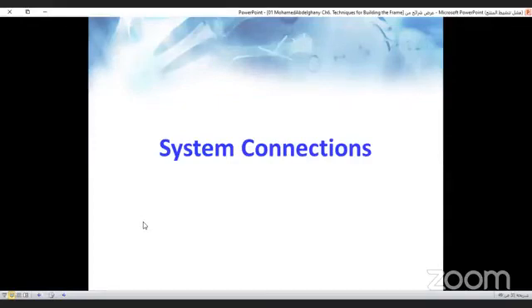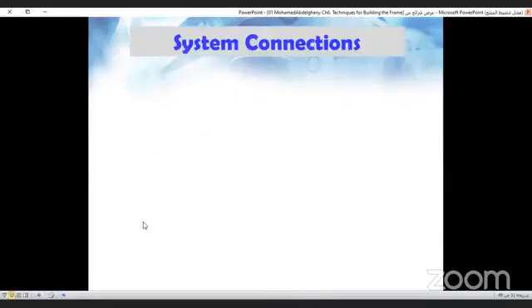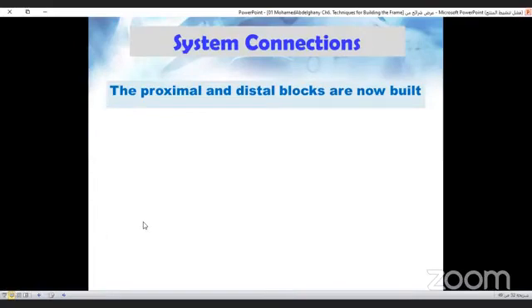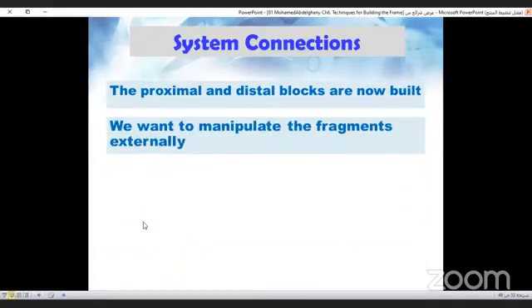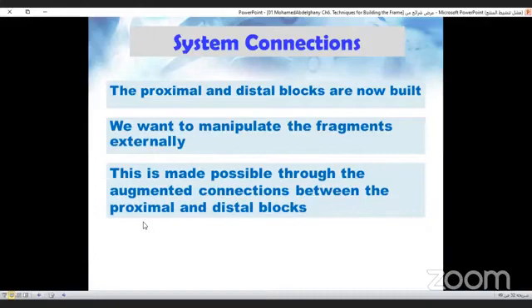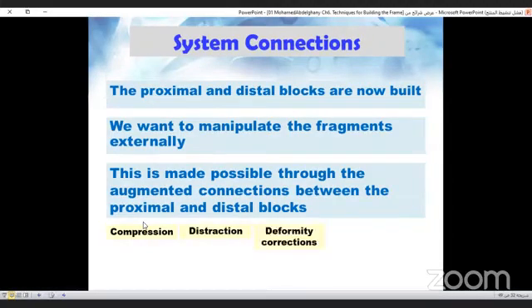Now we come to the system connections. The proximal and distal blocks are now built, and now we want to manipulate the fragments externally. This is possible through the augmented connections between the proximal and distal blocks. So we can do compression, distraction, deformity corrections in the form of translation, rotation, and angulation.